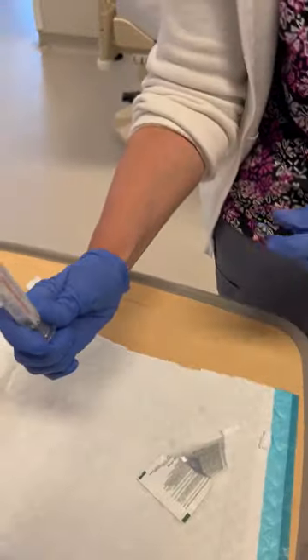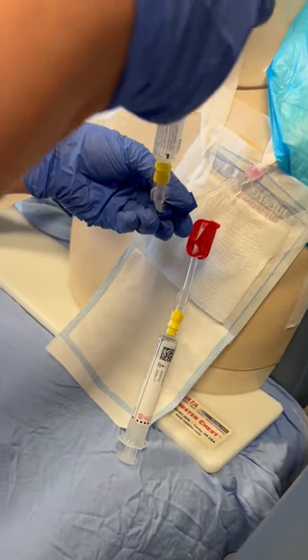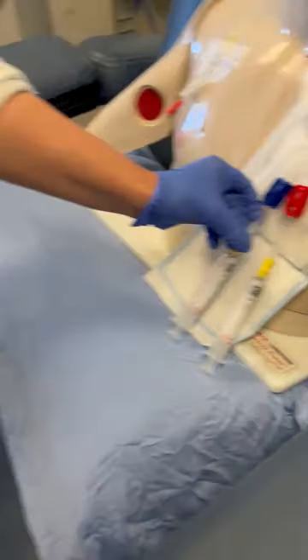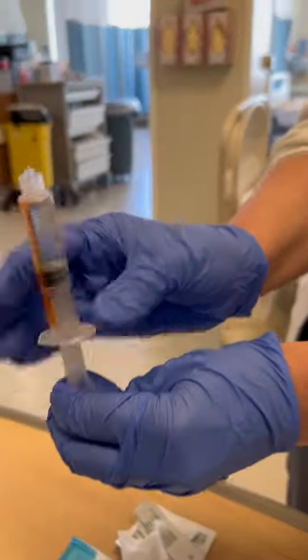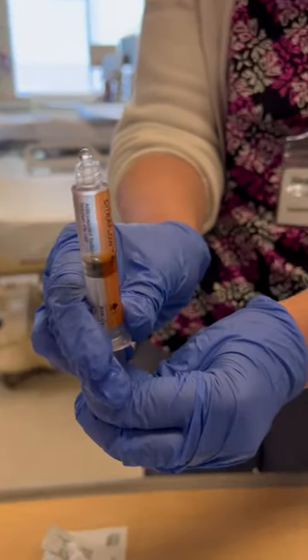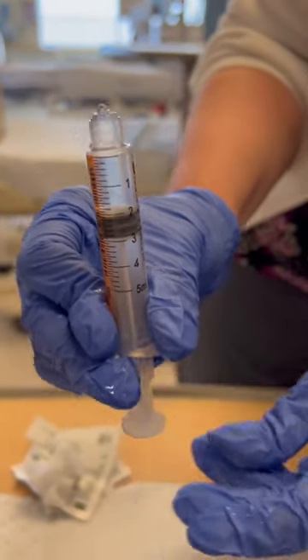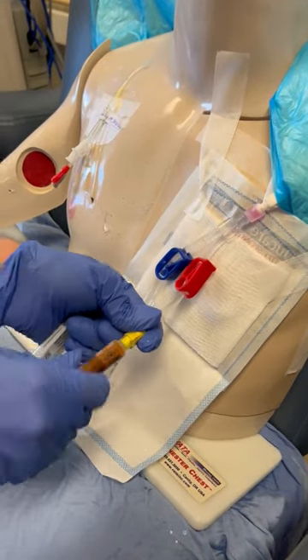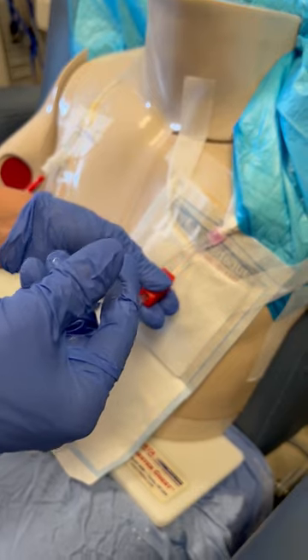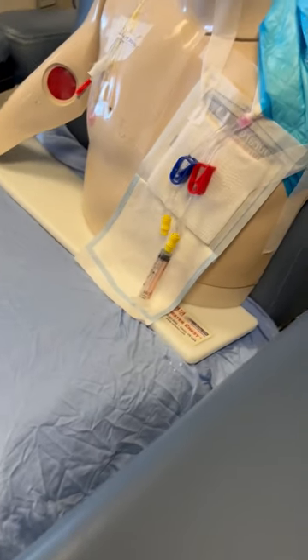Grab our 10 ml pre-filled saline syringe, remove air bubbles, clamp, hold the syringe upright, and flush turbulently. We've got a sodium citrate syringe, also called citraflow, and we're going to remove any excess amount. If your lumens are 1.9, you're going to want to put 2 ml of the locking solution in your lumens. With sodium citrate, we want to instill it with positive pressure — that means pushing in and clamping as quickly as possible. We can repeat on the venous lumen; it's a good idea to leave that syringe attached so you remember which one you've done.